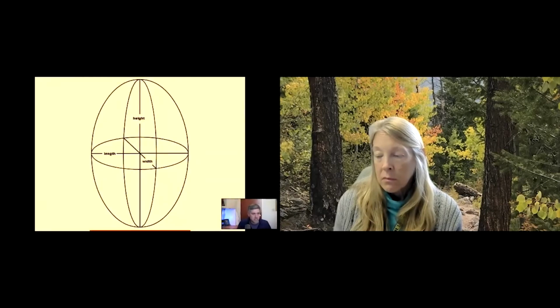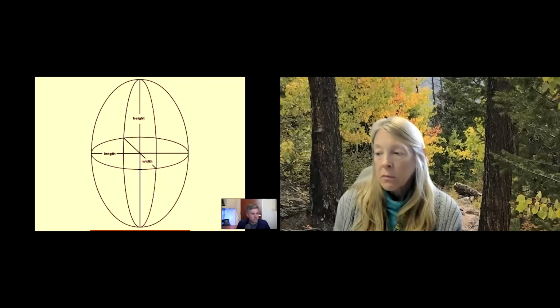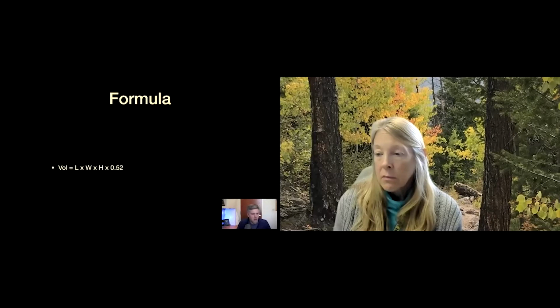And so essentially what you're going to do is, in two-dimensional space, construct this three-dimensional model of some form of a spherical structure, right? This is just an image that I found of an oval-shaped spherical structure on Google, but it shows you that there's three cardinal dimensions that we're really trying to identify: the height, the length, and the width of this bladder, to get these three measurements.